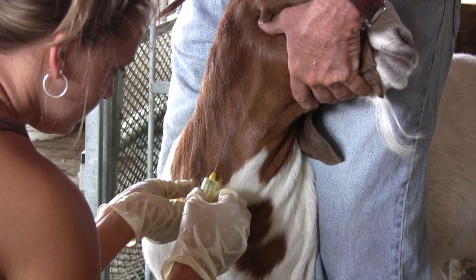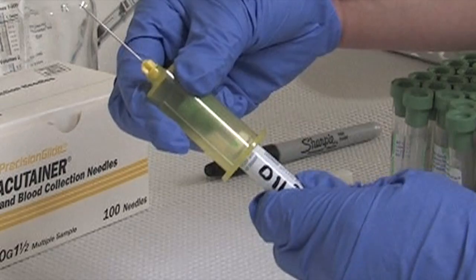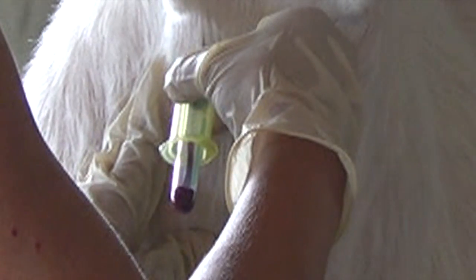The needle holder should be guided into place with the right hand while the left hand holds off the vein. Try to aim for the center of the vein so you have a greater chance of placing the needle within the vein. Once the needle is in place, apply pressure so the vacutainer is pushed up onto the needle. If the needle is in the vein, the blood will start to fill the container immediately.